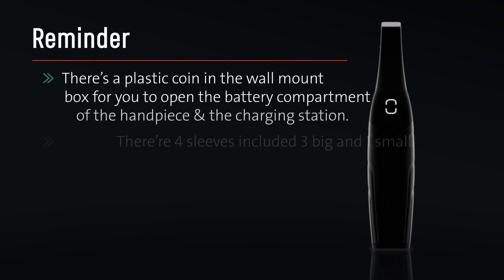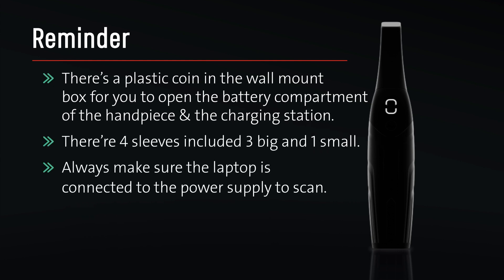Reminder: there is a plastic coin in the wall mount box to open the battery compartment of the handpiece and the charging station. There are four sleeves included — three large and one small. Always make sure the laptop is connected to the power supply to scan.